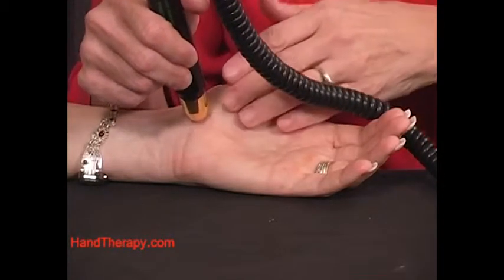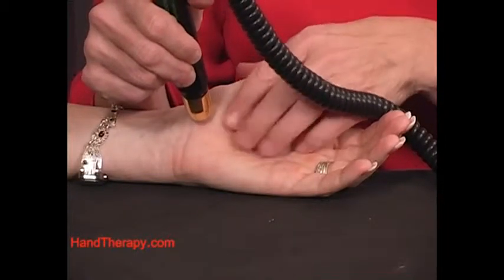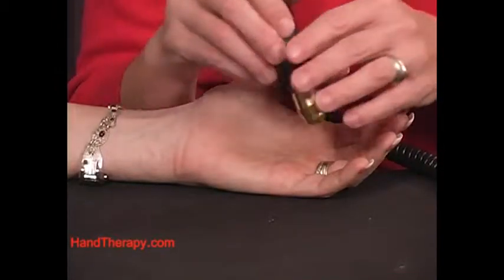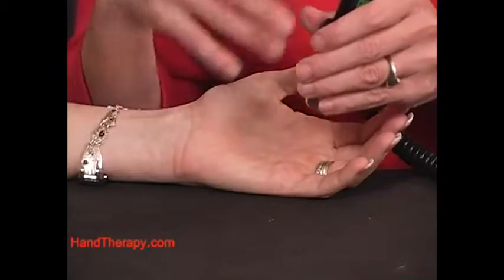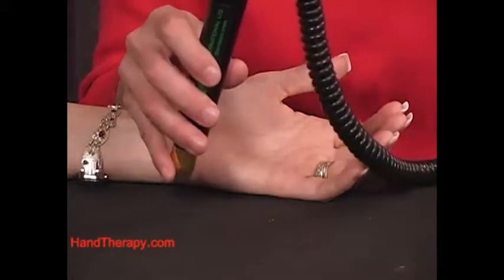Another thing you can do if you're treating a wound that does not have skin is that you can do Tegaderm. You can put it over them. Now remember, the Thor is approved for musculoskeletal, not the wounds, but these are the hints for the things that you're doing. Okay, so now back to the post-op.